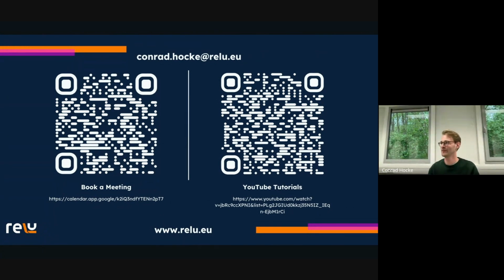And David, any certification regarding the accuracy of the segmentation results? Under relu.eu/evidence, we offer all the research that has been done using our models and comparing it to the accuracy of other automated segmentation softwares. Really, you can see there how accurate it is. We're industry leading regarding the segmentations of a CBCT. Yeah, we're also quite far with our 510K and CE certifications. If that is what you were wondering there.